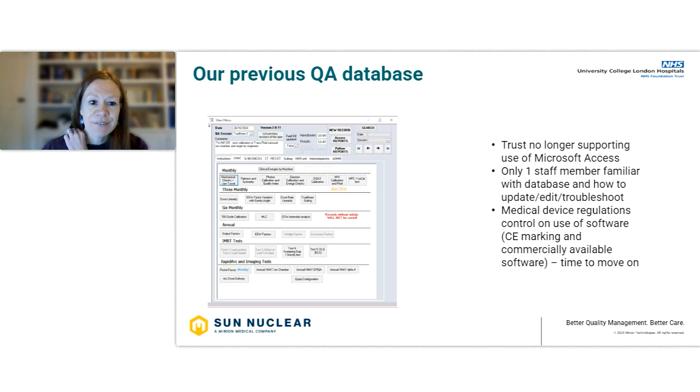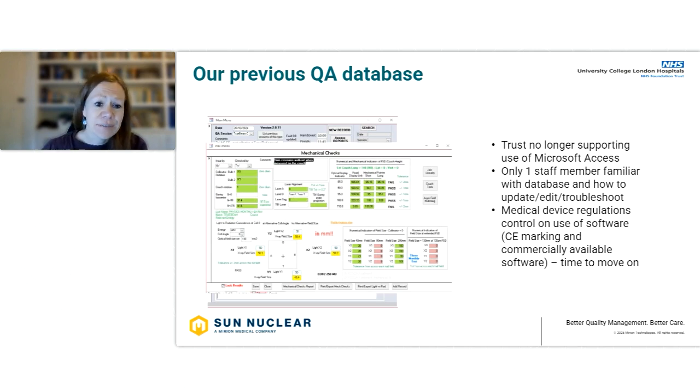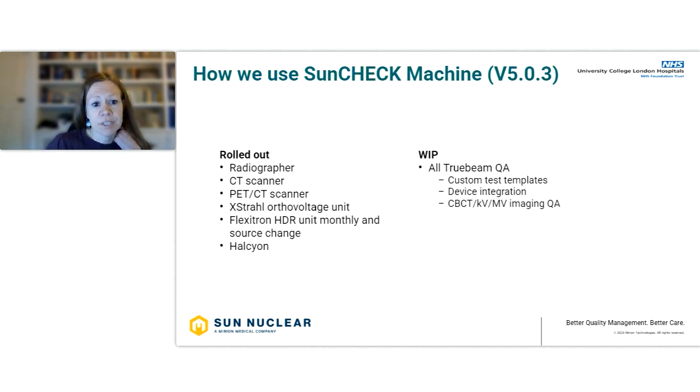Prior to SunCHECK, we used to have our own in-house Access database, which had some lovely customizable forms, but terrible ability to trend data and do reports. And also our trust stopped supporting Access, and really the staff competency with the database, in terms of maintaining it, wasn't there anymore. And the UK medical device regulations strongly suggest that if there is a commercially available solution for something you want to do, you should be using that instead of in-house customized software. So we're now entirely based in SunCHECK Machine.